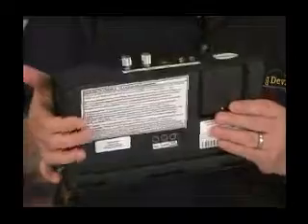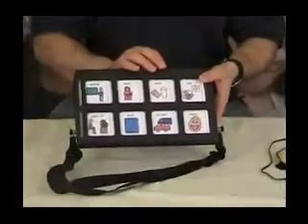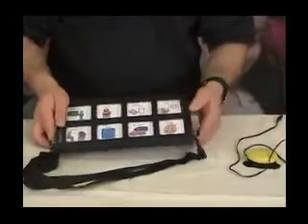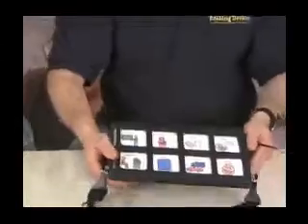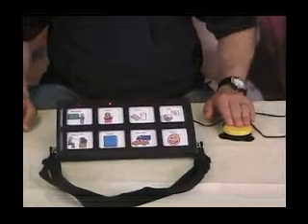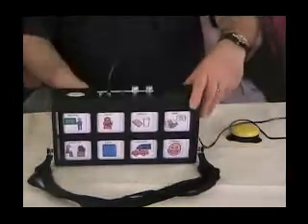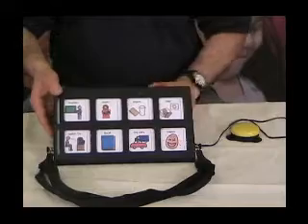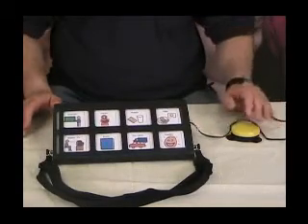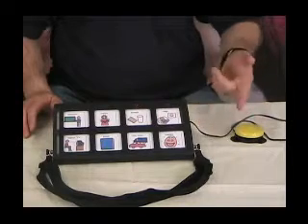Let me start by showing how the machine works. The first mode is inverse scanning with a single switch. I'll press the auditory cueing button — now it's going past each icon. When I release the switch, it plays back: 'Watch TV.' With auditory cueing on, especially for someone who is visually impaired, the user can hear the message as it scans — for example 'Teacher,' 'Mom,' 'Snack' — playing at a lower volume.